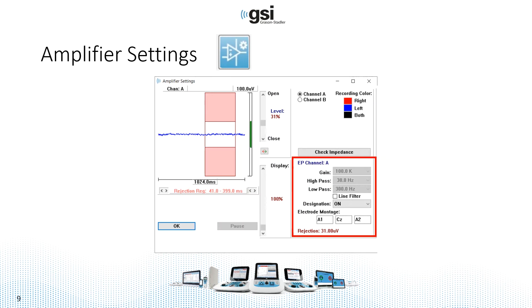Now when we do ABR, our filter settings and our gain settings are critical depending on the tests that we're collecting. So from ECOG to P300 to VEMP, those parameters change.